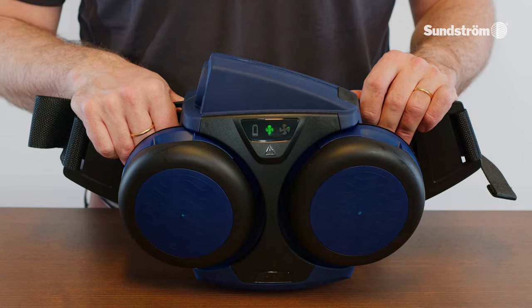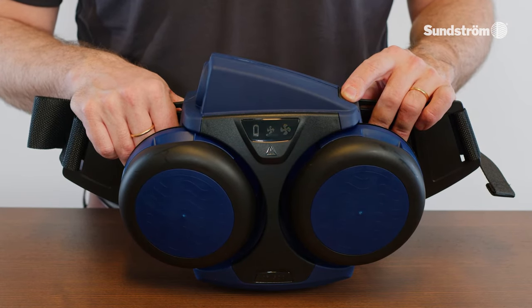To switch off the fan, keep the control button depressed for about 2 seconds.